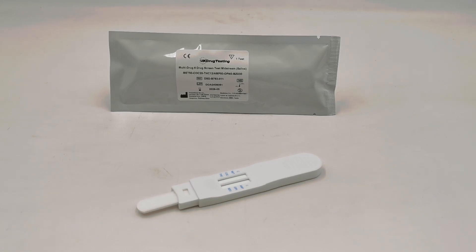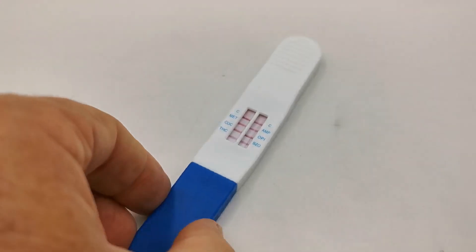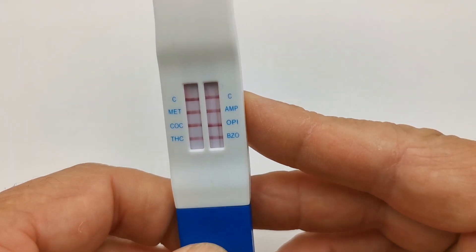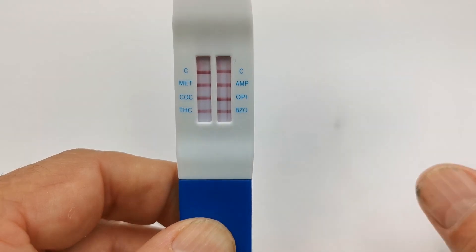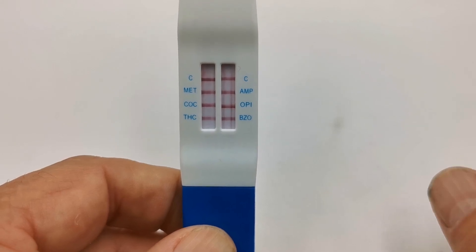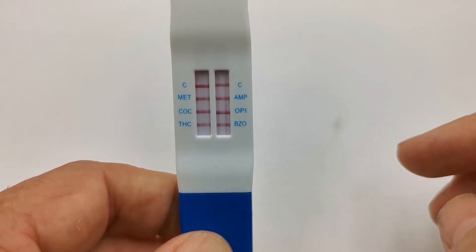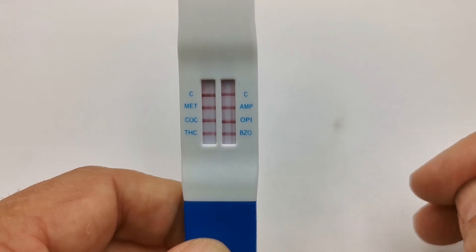We've run this test on a negative saliva sample and this is the result showing at five minutes. In an all-negative test, the control and test lines form quite quickly, making it a fast test to run. As soon as you have a control line showing at the top of the column against the C and all your test lines showing, this is an all-negative result for each of the six drug groups. Those test lines won't fade or disappear over the next five to ten minutes, so you can interpret this as a fully negative result.